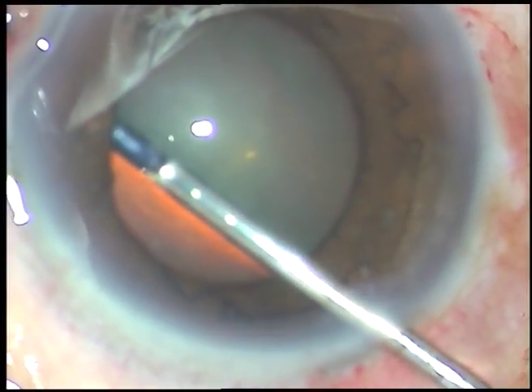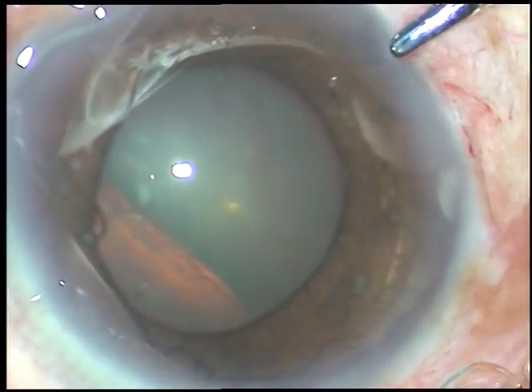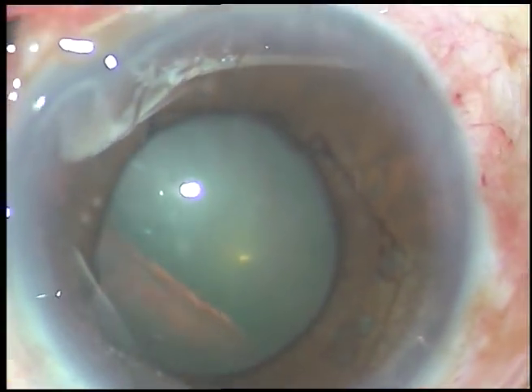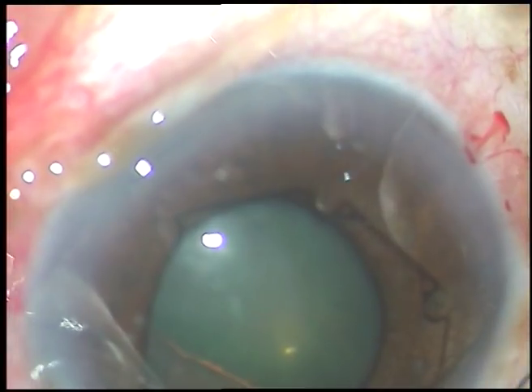I have done many cases with high intraocular pressure. First I do a small paracentesis, decrease the intraocular pressure gradually, and then take up the case. So far nothing has happened.